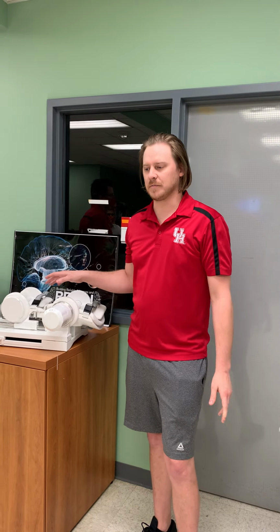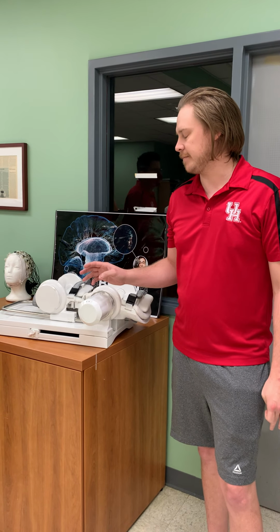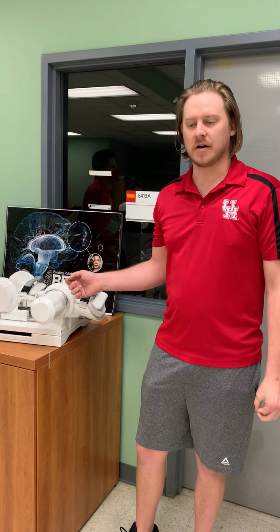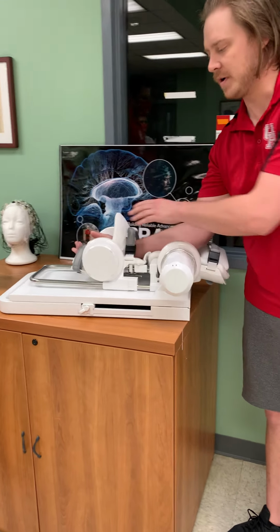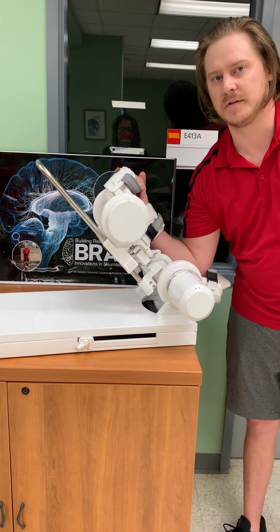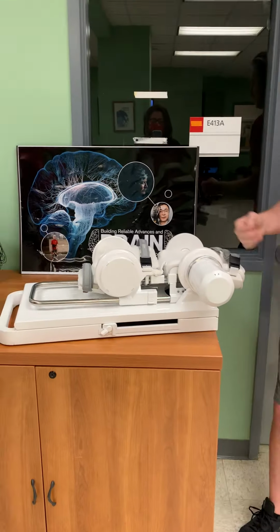Hi, I'm Alex Craig. I've been a third-year PhD student under Dr. Contreras. The main focus of my research has been on the NeuroExo project, the NSF-funded NeuroExo project, where we're intending to design a brain-computer interface system. This includes a custom headset, custom electrodes, custom amplifier, and processing with LabVIEW over a third-party processing board. The current focus of this system is for a stroke rehabilitation scheme, where we're measuring the user intent and sending a control signal to a robotic arm made by our partners at Harmonic Bionics. But we're very excited to continue development of this system for other applications, such as gaming and virtual reality.